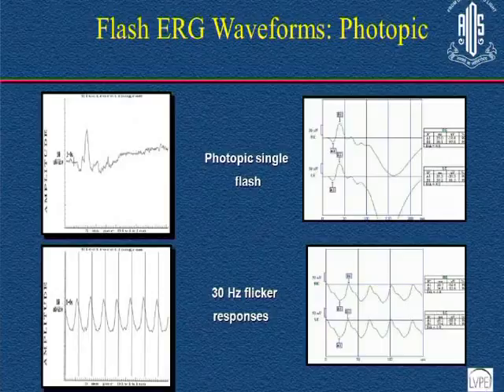One thing one must remember is that these flash ERGs are mass responses. So they don't get affected a little bit. If there is a pathology, they will get affected a lot. It's not that something was 200 microvolts and with pathology it becomes 189. No, it will become 50. It will become 80. There's a huge difference between normal and abnormal, and there's no difficulty in saying this is normal or abnormal or subnormal. It's not that 200 becomes 180 and now it's abnormal. That's the test-retest variation of this test.